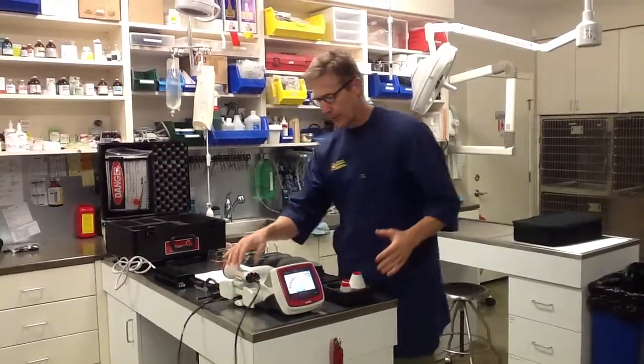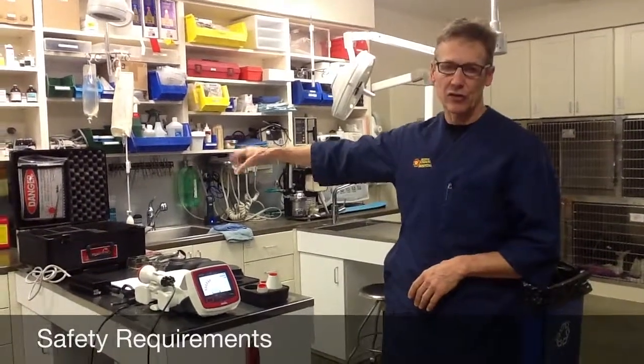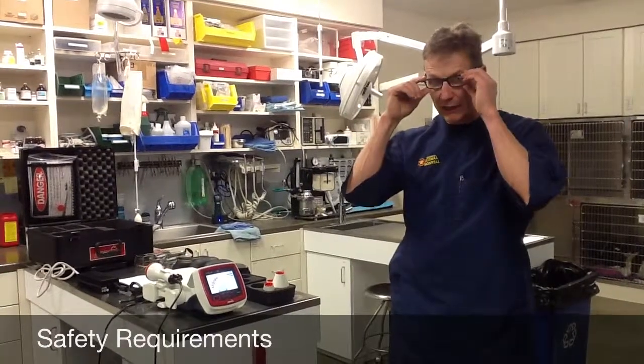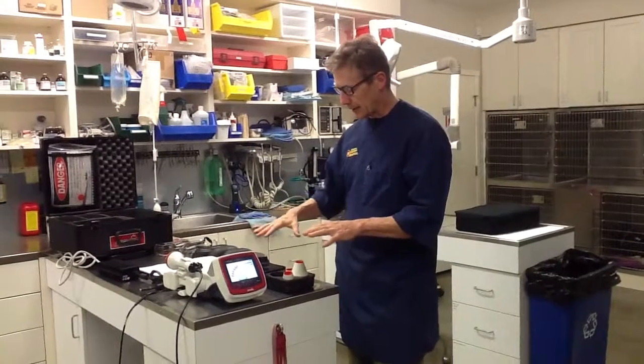Let's talk a little bit about safety — probably one of the most important things. There are two main requirements. One is that you have your danger laser-in-use sign posted. Two is that you have protective eyewear on people and animals within a four-to-five foot radius of the animal being treated. Also, if you're on reflective surfaces like a stainless steel table, cover it with a towel or blanket so the light doesn't bounce back at you. Remember that the two therapeutic wavelengths that can cause eye damage are invisible — the aiming beam is there to warn you where the light is going.